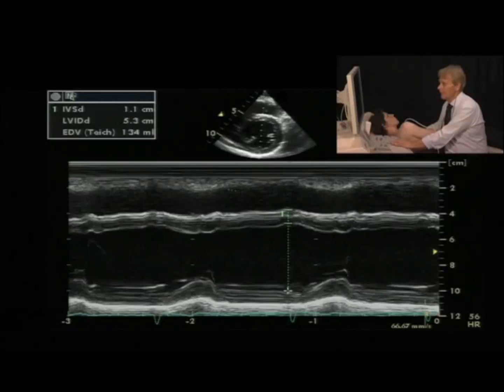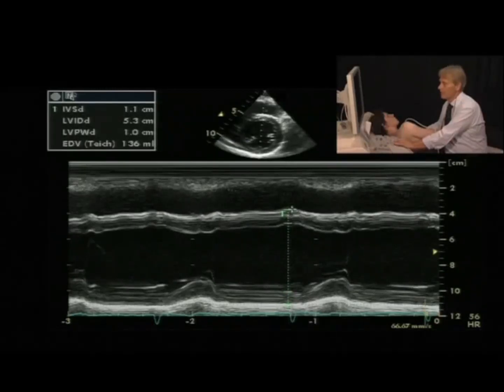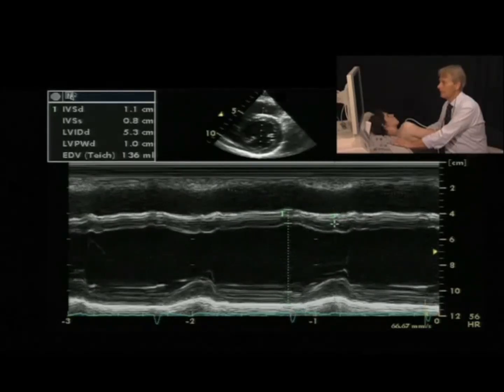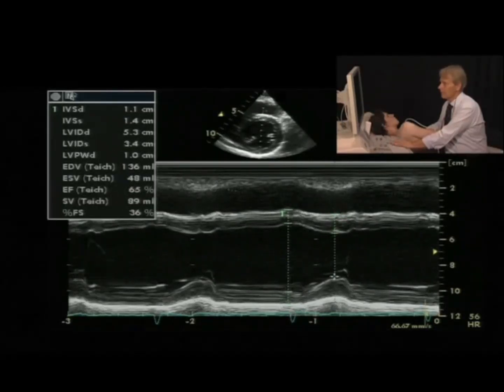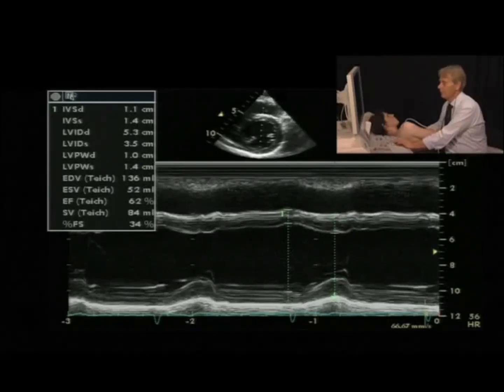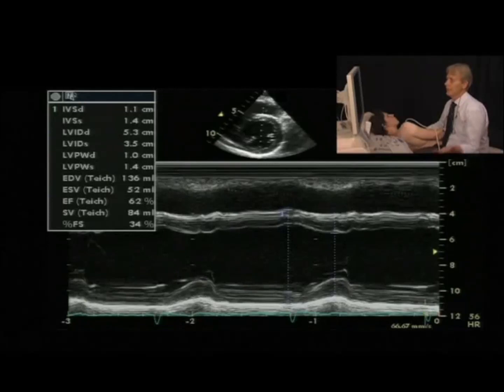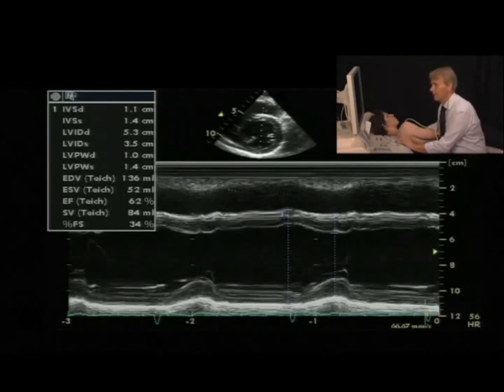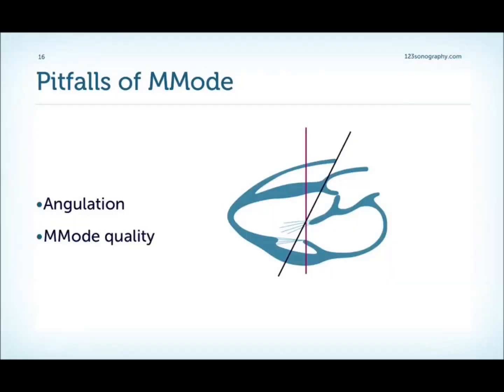Then measure the end-diastolic diameter and the posterior wall. All these measurements are at diastole, and then you perform the same measurements at systole for the end-systolic diameter and the posterolateral wall. Be careful to get a perpendicular orientation of the M-mode beam to the walls of the left ventricle — without that, you may overestimate the size of the left ventricle.